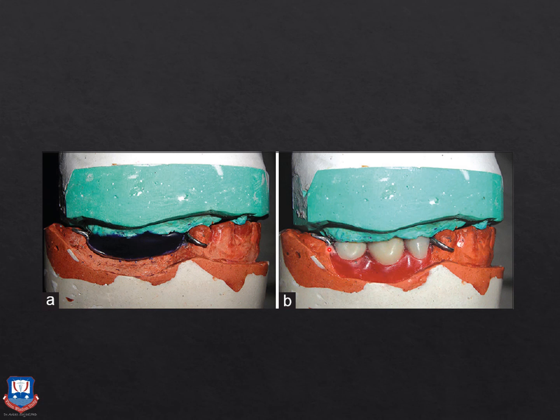The idea is that the teeth are in a sort of balanced occlusion, in complete harmony during protrusive, eccentric, and left and right lateral excursive movements. This will not dislodge or put excessive forces on the edentulous residual ridges under the denture bases. So this is a dynamic method, where all the movements are recorded and then the teeth are set. The occlusal scheme is designed according to the functionally generated path.